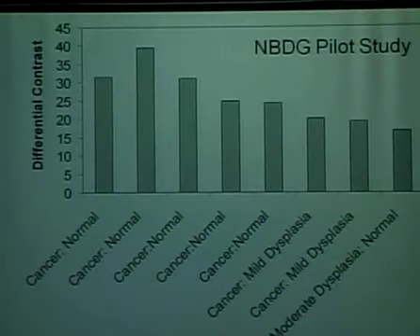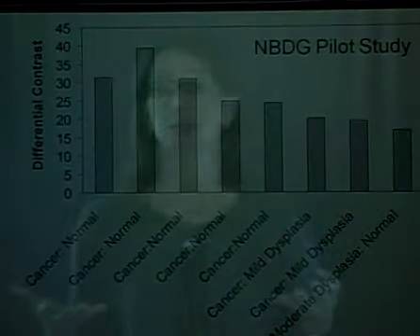In a study that looked at 16 biopsies, they were paired biopsies obtained from the same patient. We obtained wide field fluorescence images before we applied the deoxyglucose, and then applied the deoxyglucose and obtained wide field images after that. And we looked at the increase in fluorescence post relative to pre. And what that allows us to get at is two things.